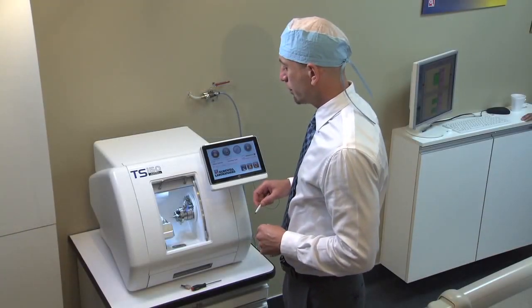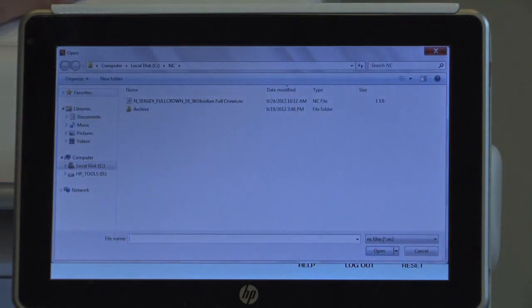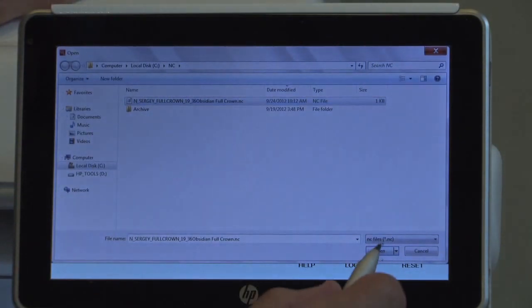You are now ready to mill your case. Press the Change Program button to display the available cases. Select the case that you wish to mill from the list and press Open.